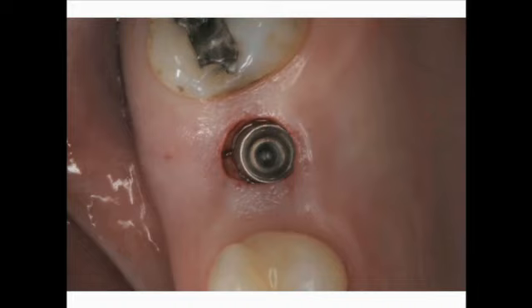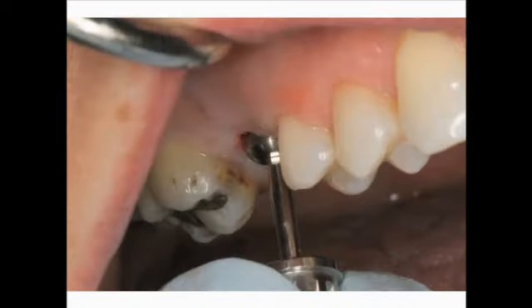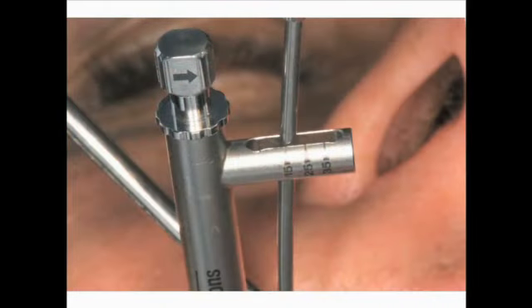This is an occlusal view of the implant in position immediately after placement through the tissue. You can see there's very little bleeding, very little trauma. The healing abutment is placed into the internal design of the Cybron implant and tightened. Here we'll go back and use our torque ratchet to place our healing abutment into the implant at 15 Newton centimeters, which will prevent any loosening during the healing phase.